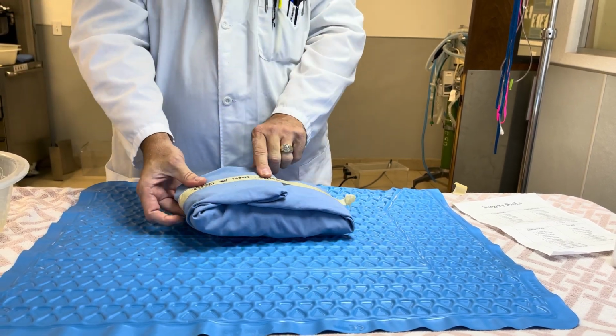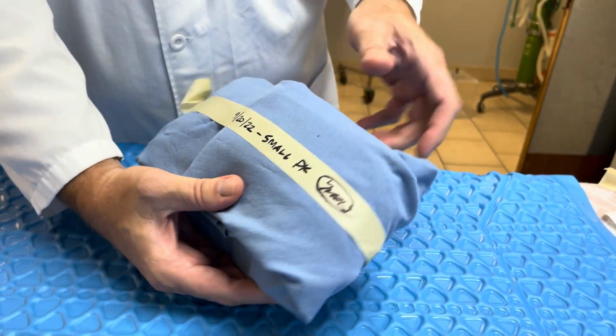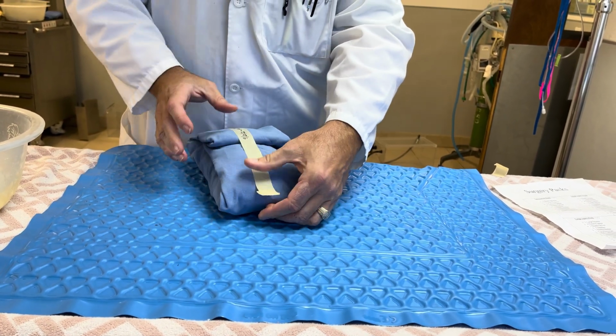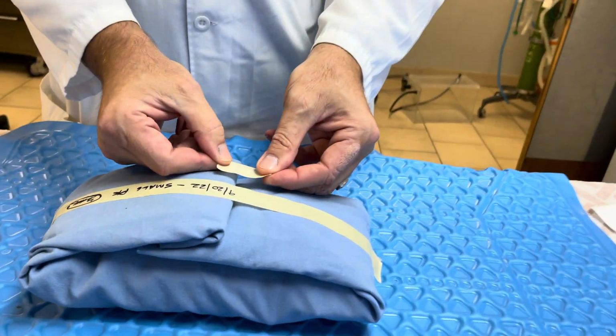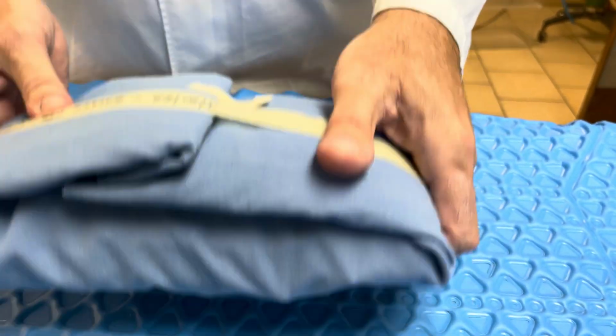I've already put the date, the type of pack, and my initials on here, okay? And then make sure you leave a little tab at the end of the tape so that when the doctor has to take it off during surgery, when they prep for surgery, they can take that off. And then the last thing is this little piece of autoclave tape, and it changes color once it's been autoclaved.